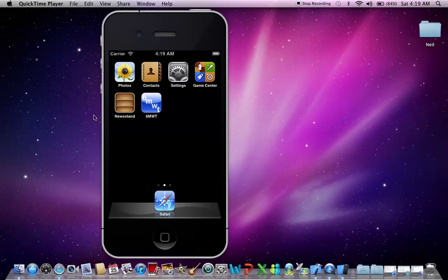Hi there guys, it's Neil here. I'm going to show you my demo of a six minute walk test app that I've developed for iTunes, Android and Blackberry.